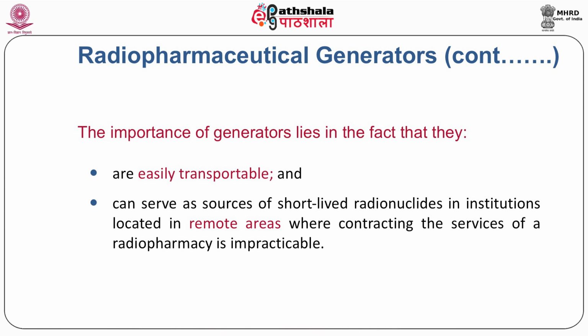So this is one production method by which technetium is produced, a very important way, used in most nuclear medicine departments in our country.